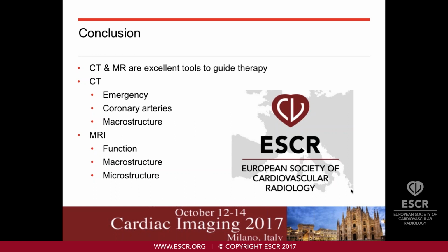We will hear in the next webinar an extensive answer, but do you think hybrid imaging has a role in structural heart disease and how often do you use it, in which clinical scenarios? We showed beautiful cases of PET clarifying a series of clinical conditions. What's your idea about current PET-MR and PET-CT in structural heart disease?